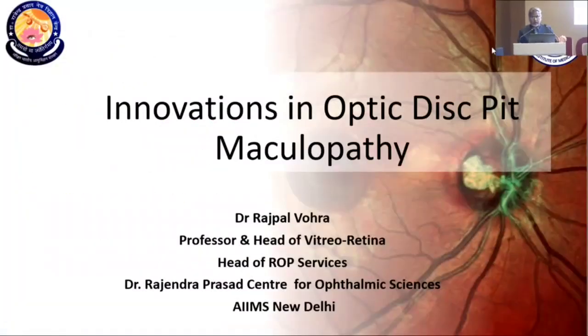Optic disc maculopathy diagnosis has improved these days because of the advancement in OCT. Earlier, we were not able to diagnose, and still we are unable to diagnose many patients, who come very late, so the visibility is bad. With the advancement, we are able to follow up these cases and predict early the neurosensory detachment or the decrease in vision, so that early surgery can be done. So, innovation.